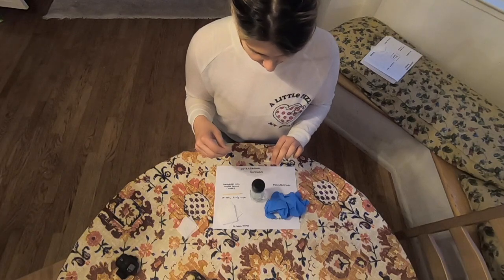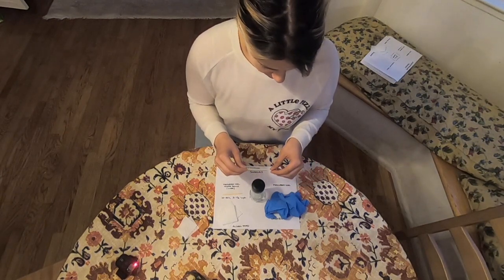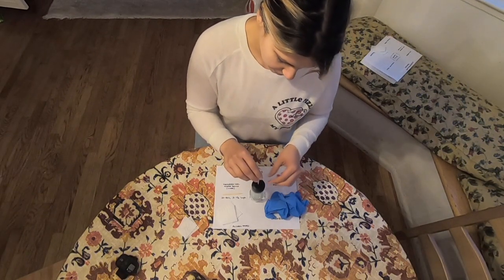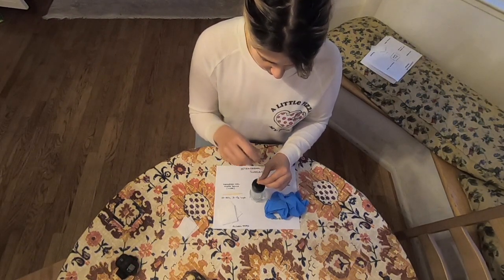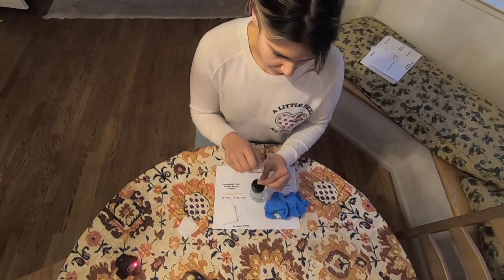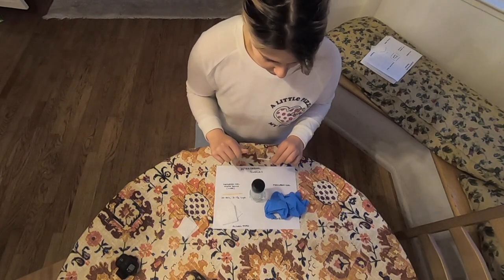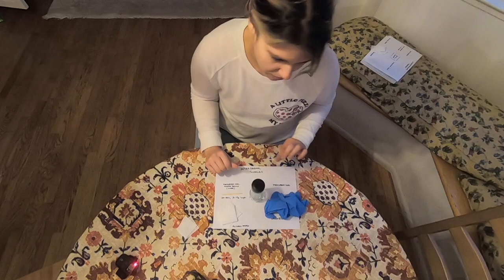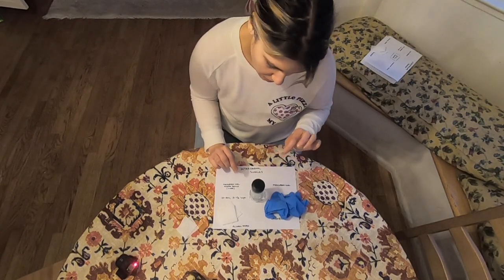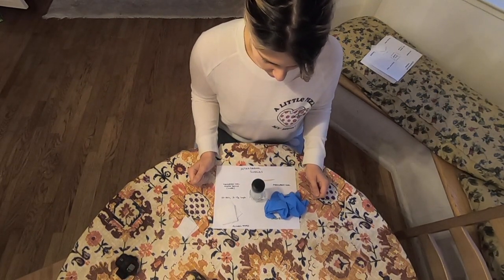We'll draw 0.1ml of air, which is the typical amount used for an intradermal injection — typically tuberculin. Poke the needleless device into the bottle, insert the air, then pull back and draw up 0.1ml of medication. Pull out the device, put the cap back on, remove the NVAD from the syringe and discard it into the sharps container. Attach the new 25 to 28 gauge, one-fourth to five-eighths inch needle to the syringe — now ready to administer.